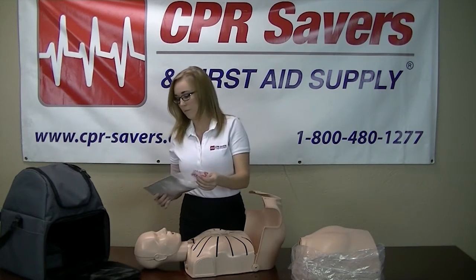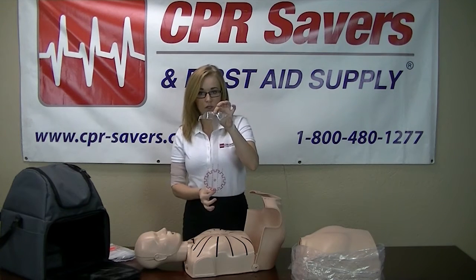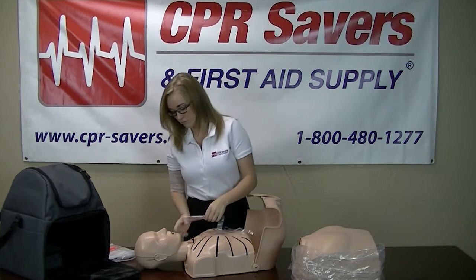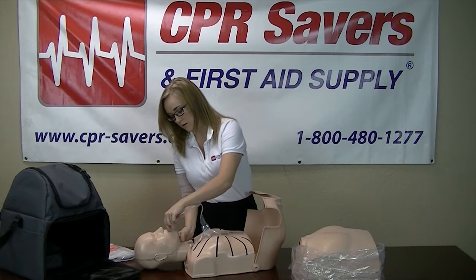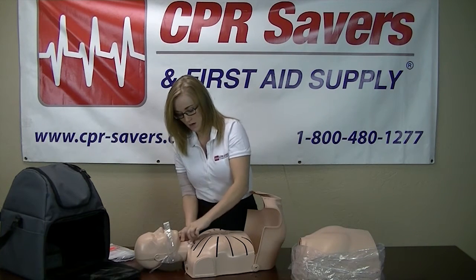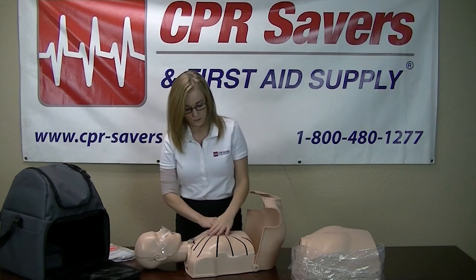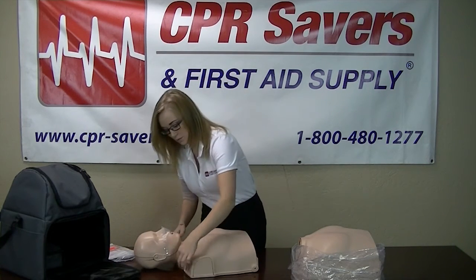Next, you're going to install the lung bag. Each lung bag comes complete with its own face shield for each mannequin. You're going to take this, just fold it up. You're going to tilt the chin on the mannequin, take the lung bag, slide it down the mouth, and it'll come out the bottom of the neck. Take the red grooves that are on the lung bag, place it on the chest over the center, then just place the skin back down.